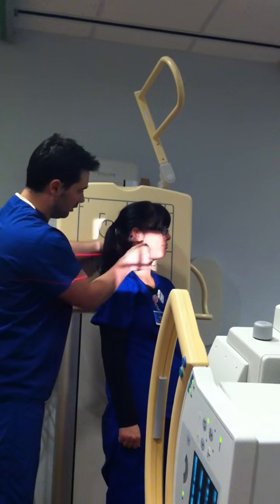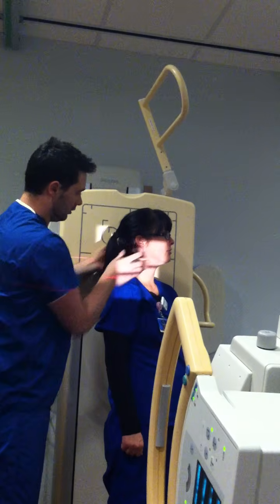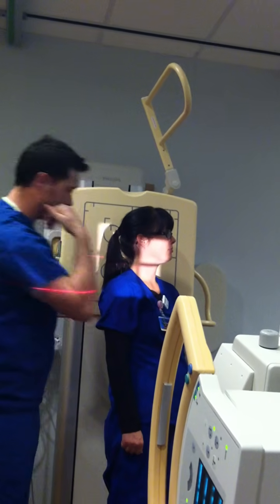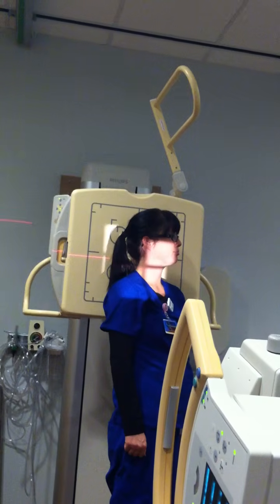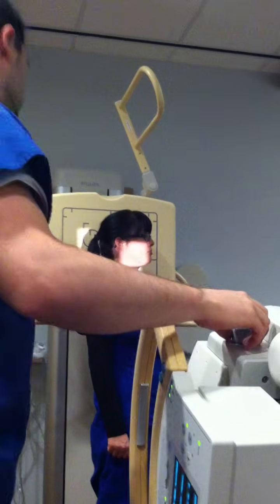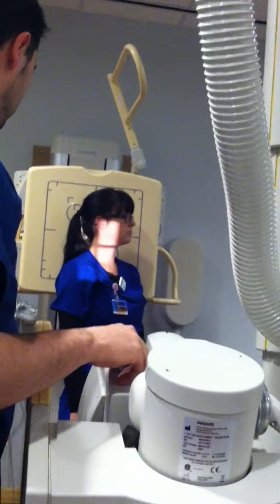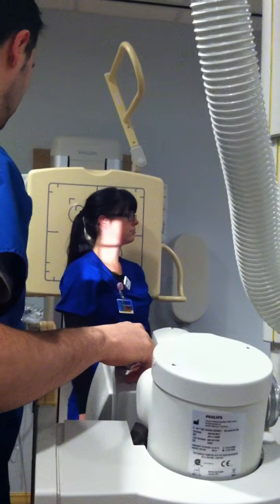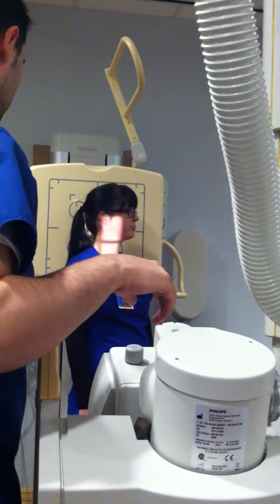Okay, so talk us through. What's your angle of the body? 45. Good. I want about the same thing. And I like where you're centered. So what vertebral level are we centered at? C4. Good. And you're centered kind of on the posterior aspect of the neck. The spine is posterior, so it's very nice. You have EAM down to the jugular notch. I really like it.